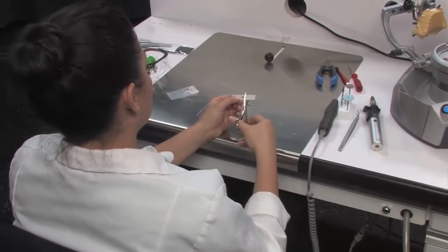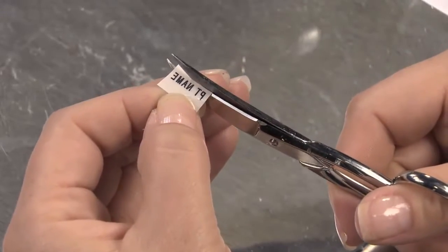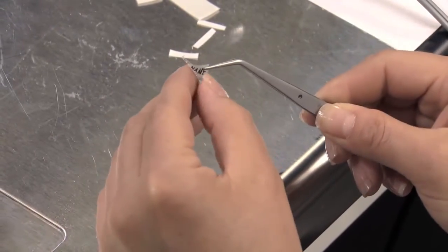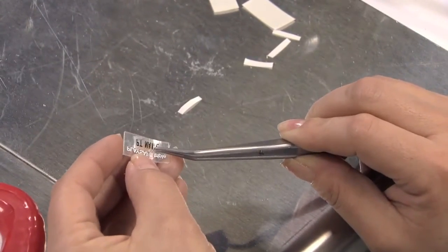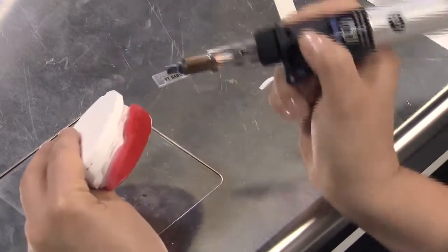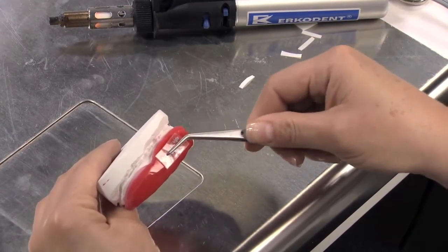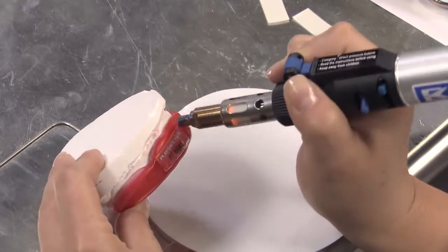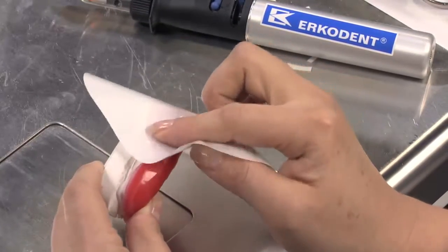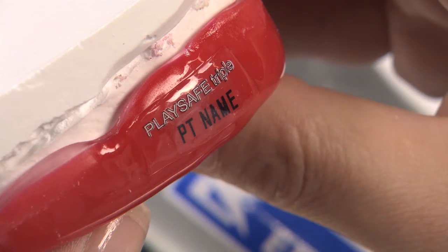To add a patient's name to the PlaySafe Triple, print the name with an electronic label maker in mirrored print mode on a clear label. Trim the label to minimize excess space around the name. Remove the backing to reveal the adhesive side, then carefully apply it to the back side of the clear PlaySafe Triple label. With the hot air burner, heat the area of the appliance where you wish to apply the label — this makes bonding easier. Apply the label to the heated area with tweezers and gently press it in. Heat the label again with the hot air burner, then use a UZF sheet to apply pressure. Switch off between heating and pressure with the UZF sheet until the label is properly seated.